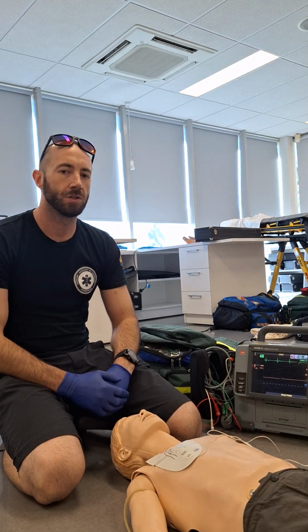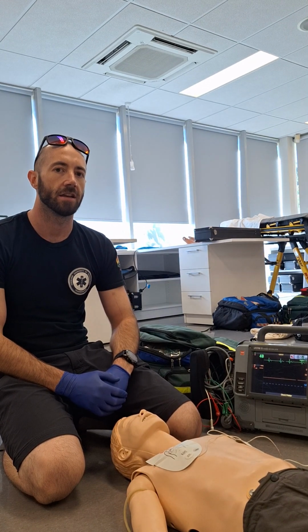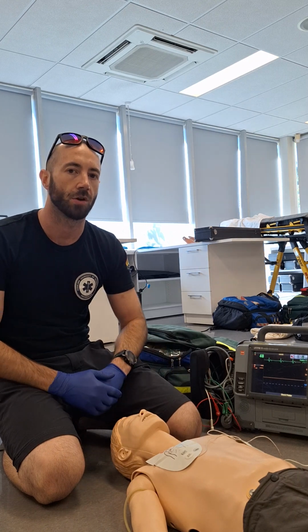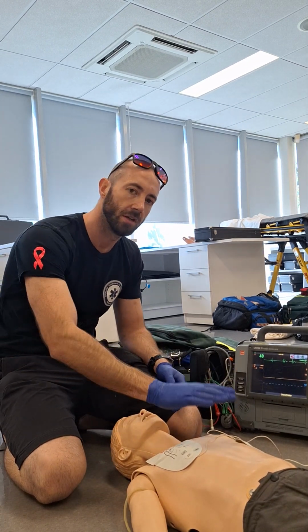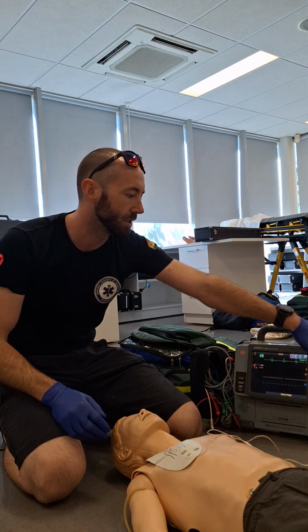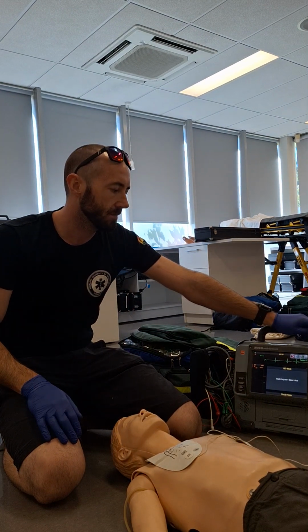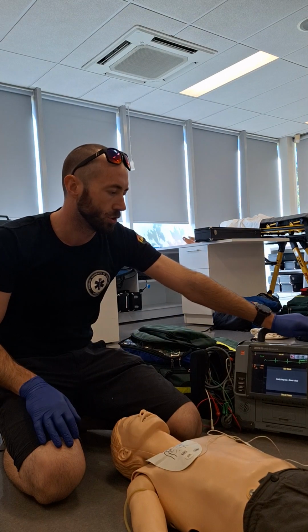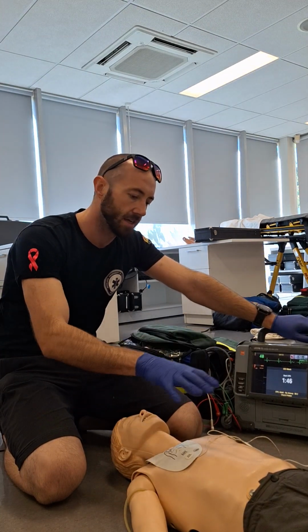Alright team, for the first 2 minutes of a suspected hypoxic secondary cardiac arrest, we're looking at our pediatric cohort primarily here. We've done our pads, we've got our crew partner doing chest compressions. Analyzing. Stand clear. We're seeing a PEA or non-shockable sinus bradycardia here. No shock advised, so my partner can jump back on the CPR.